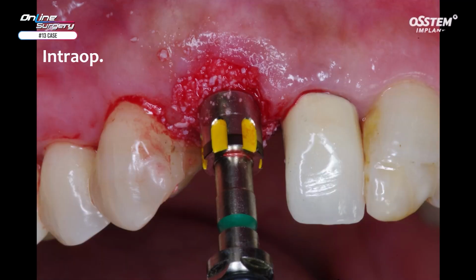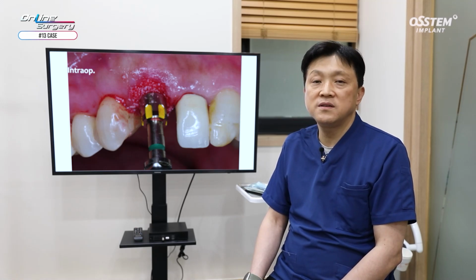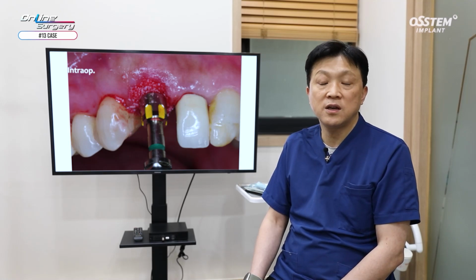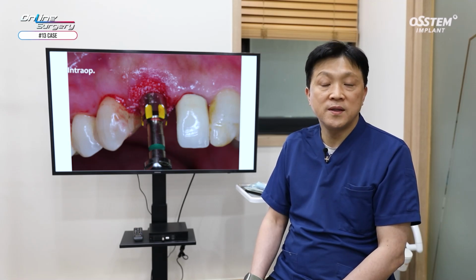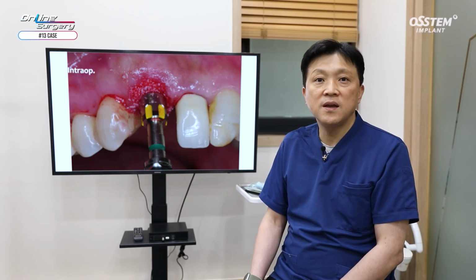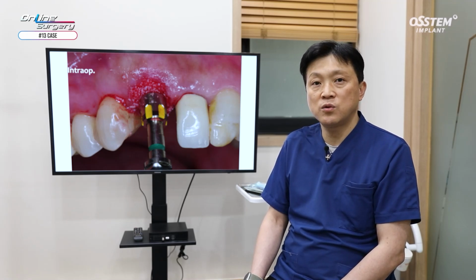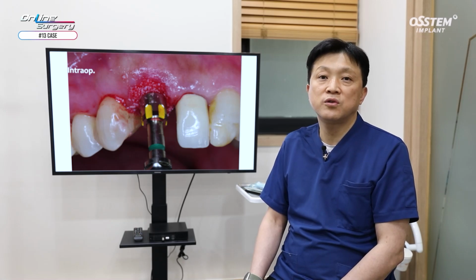The reason why AOS collagen was used was because if you take a look at dual zone concept mentioned by Salama, there's a bone zone and a tissue zone. If you use a bone graft material not only in bone zone but also in tissue zone more so than augmentation, it helps in preventing collapse of tissues. This is what is called dual zone graft concept.